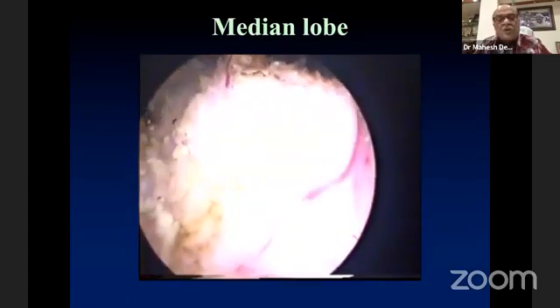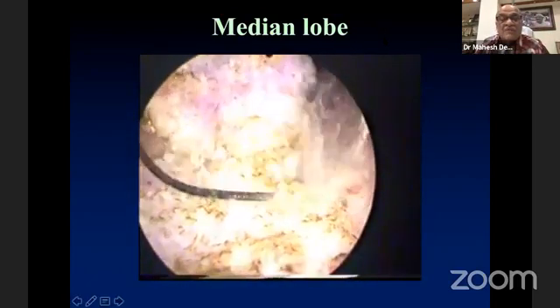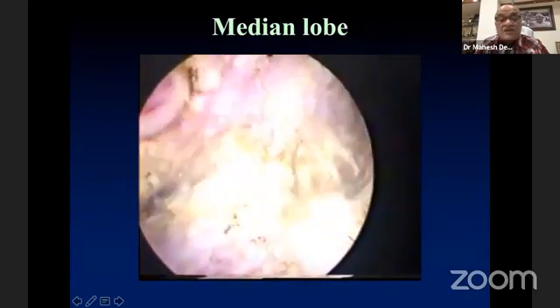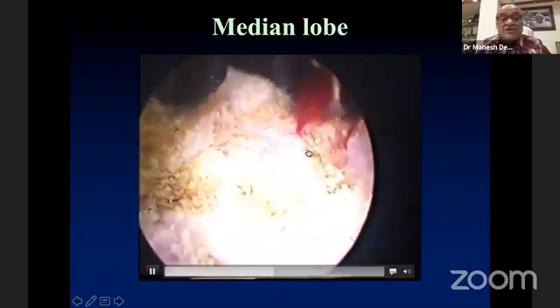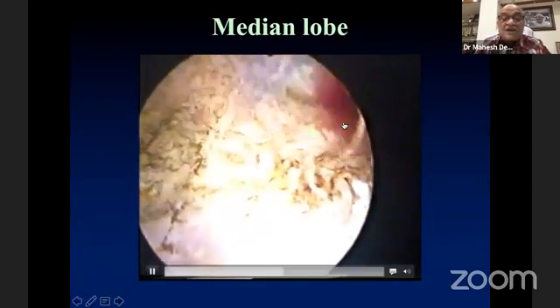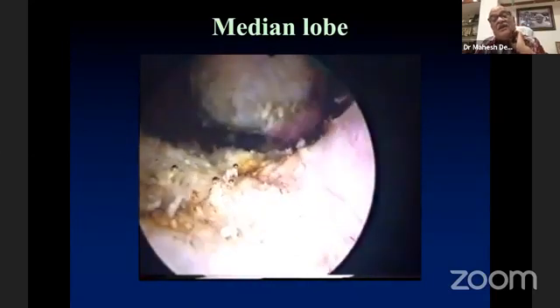In tissue, you may see the bleeding, but then you wait. Like here, you're seeing the bleeding. But you don't want to cauterize here in the tissue because it will retract, and then you will not see it. But once you come near the capsule, you must; this is still an artery. Now I have cut it, and now you can see the capsule in the distance, and after this I will cauterize the bleeding. So always cauterize the bleeder at the capsule.